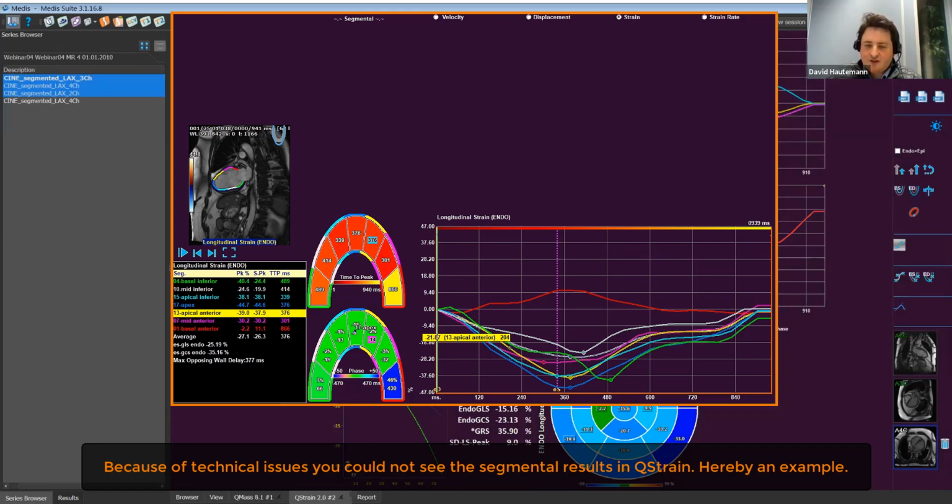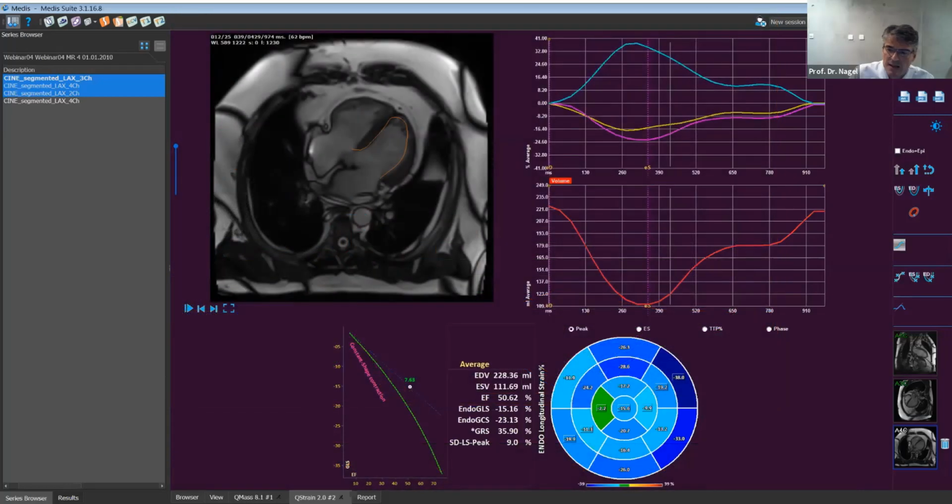Unfortunately, yes? We cannot see the screen, probably due to the Zoom. Okay. It's not showing that. Okay. Yeah, normally it will be there. Yeah. Then I'll just go back and explain quickly.